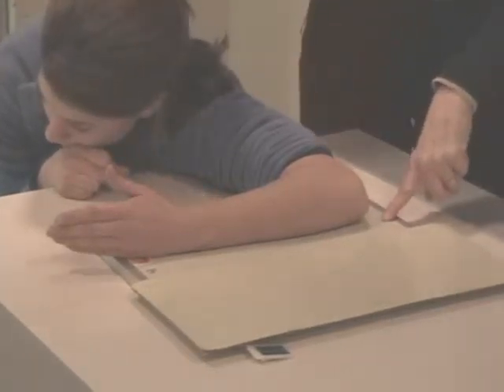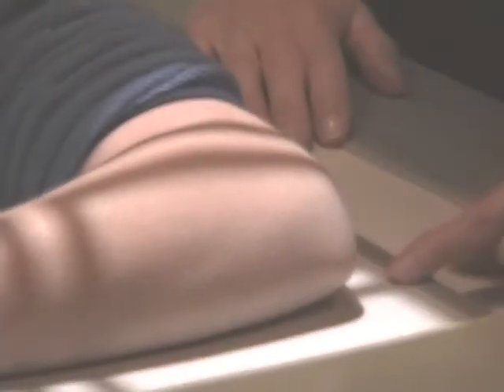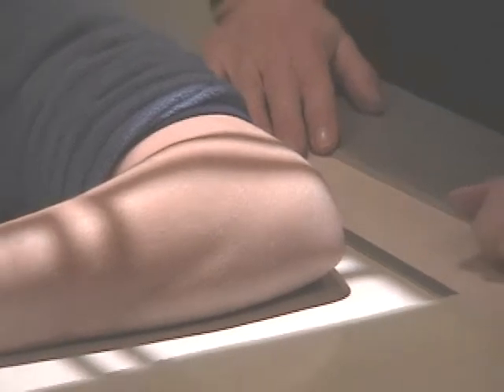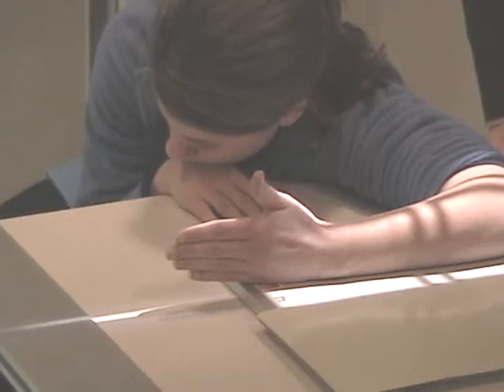Let's see if the camera can focus in on that. I don't know from this angle if it can or not. But the entire elbow shadow is included on this film, and I've got 1.5 inches here. Okay? Look at the wrist. Make sure it's lateral. The distal radius and ulna should be superimposed.